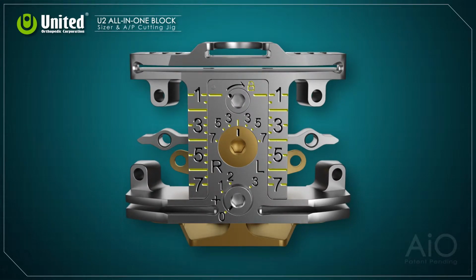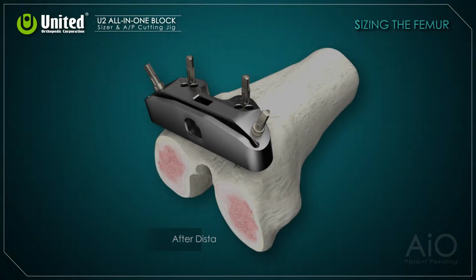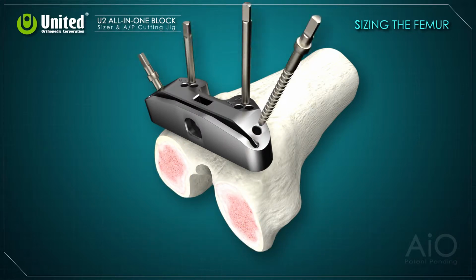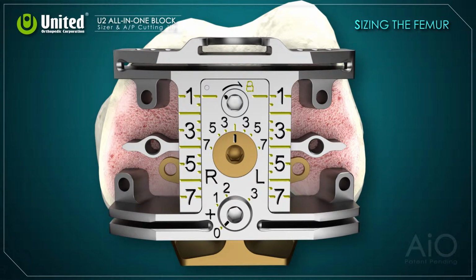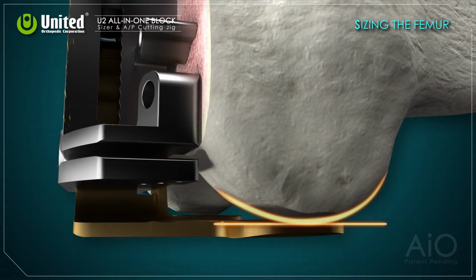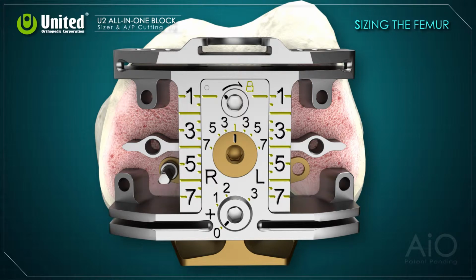All of the functions are accomplished easily by adjusting these three knobs. Sizing the femur starts right after the distal femur resection. Place the U2 all-in-one block against the resected surface of the distal femur, with the posterior feet making contact with the posterior condyles. Then, secure the U2 all-in-one block with the threaded pin through the hole marked with gold color that connects with the posterior feet.